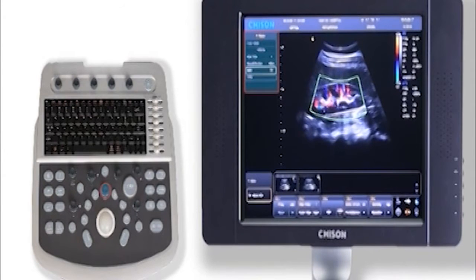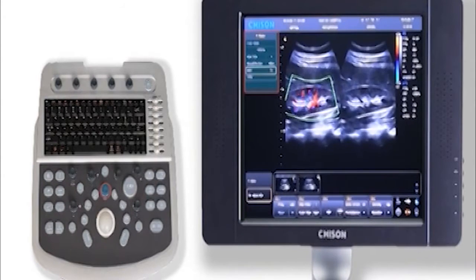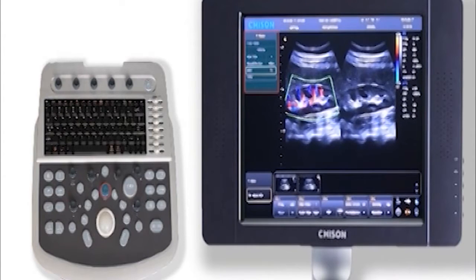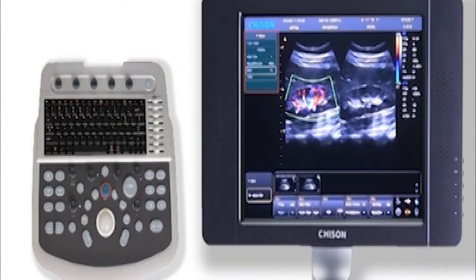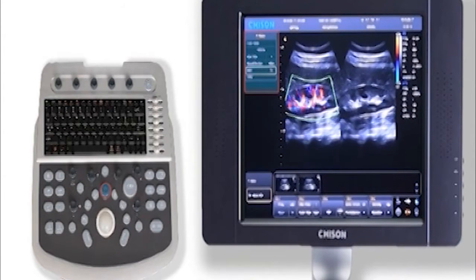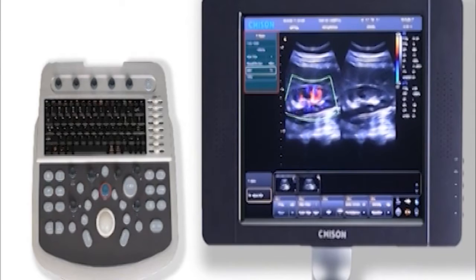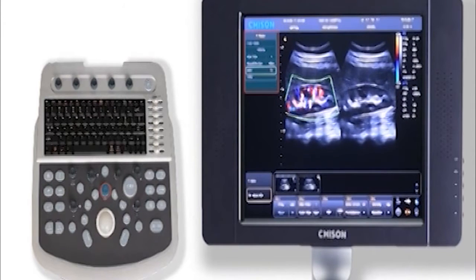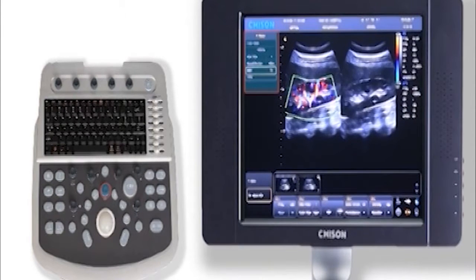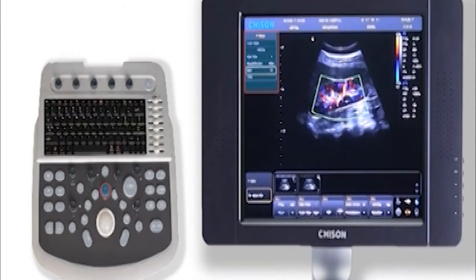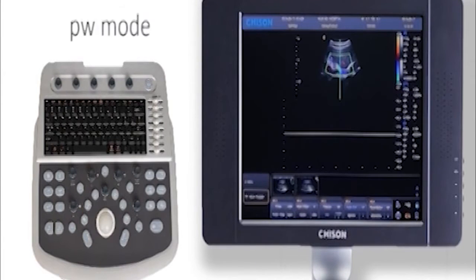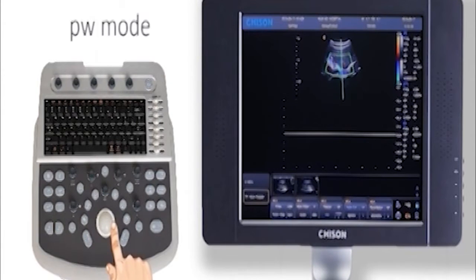Press the menu key to open the B+C mode. Press exit key to turn it off. Press this key to enter into PW mode. In this mode, roll the trackball to adjust the size of the sample gate.